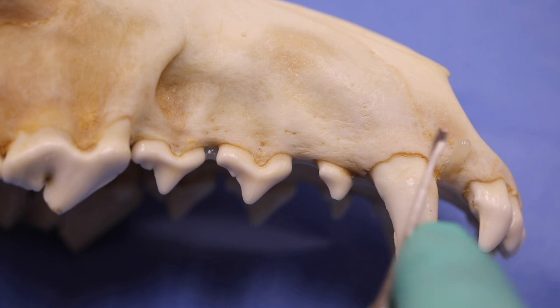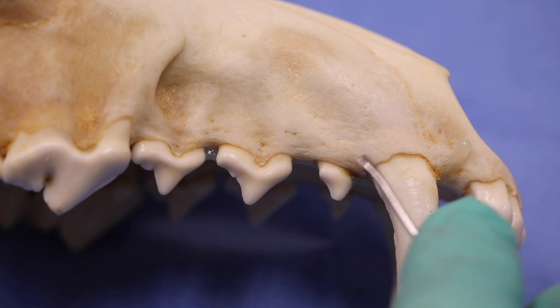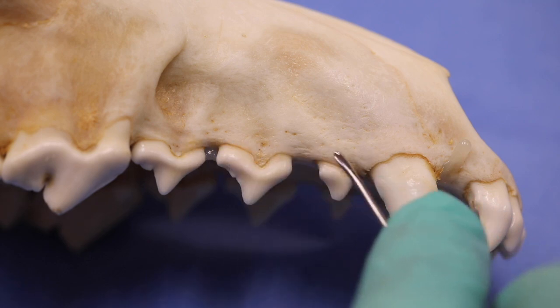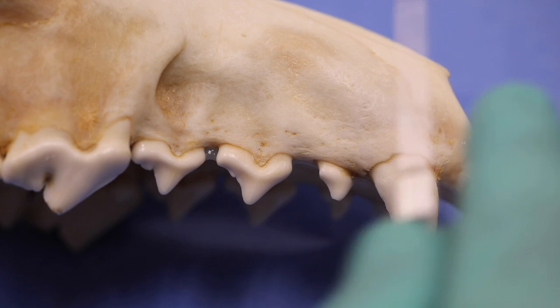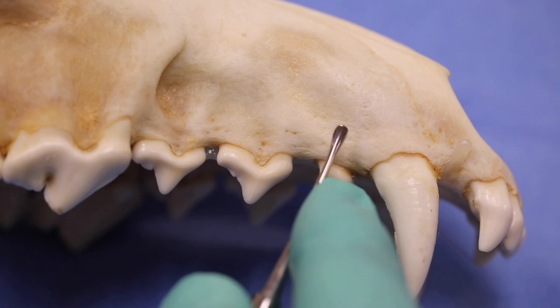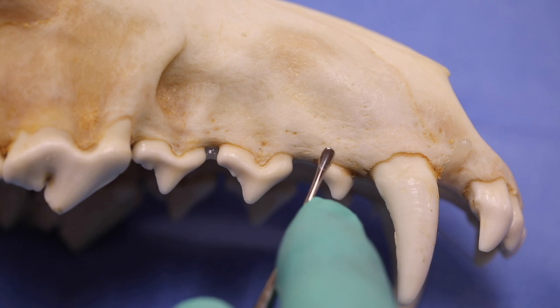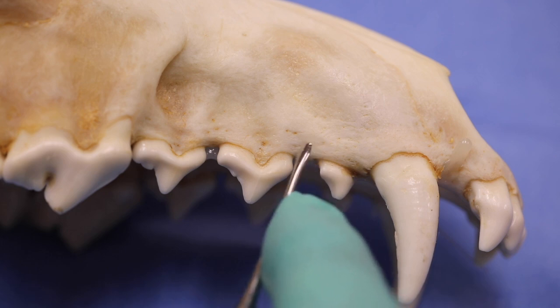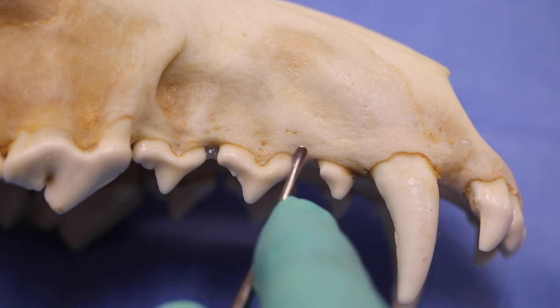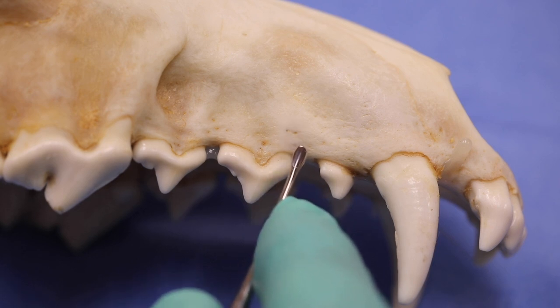Keep in mind the orientation: use the small end especially for starting that marginal elevation all the way around. You want to go the entire periphery for one to two millimeters, and then maintain that 15-degree angle. One of the most important things is we're not pushing straight in — we're actually lifting that tissue up with a torque using our fingers, so we place it and then rotate the elevator with our fingers.